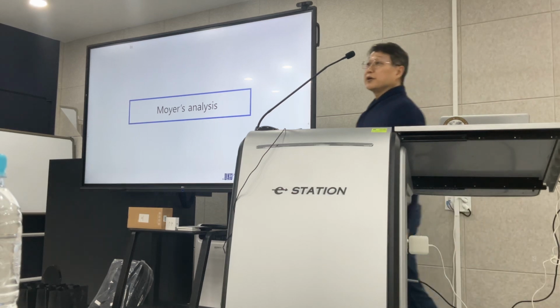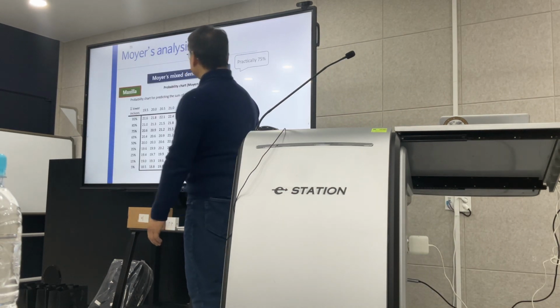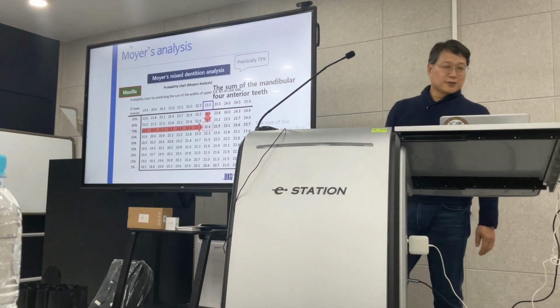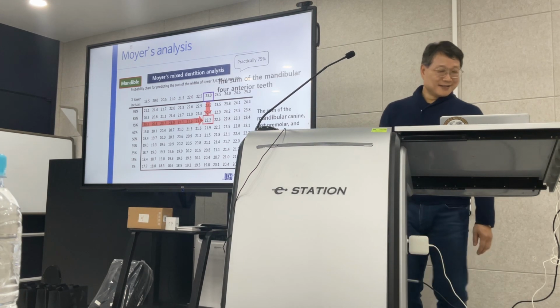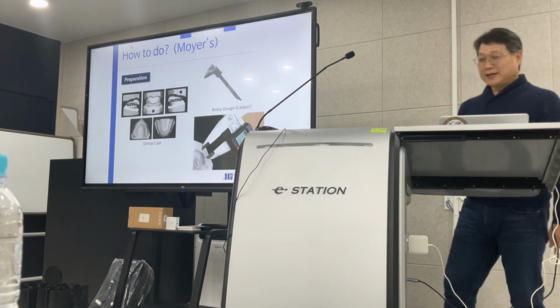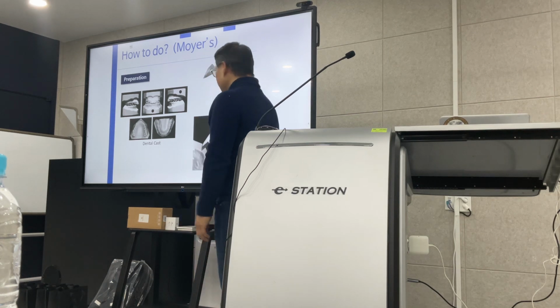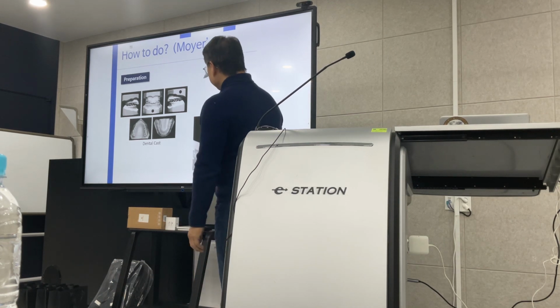We will use Moyers analysis, right? Okay, so preparation needs this kind of caliper, or this type of caliper we need.